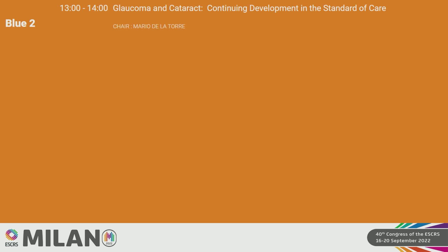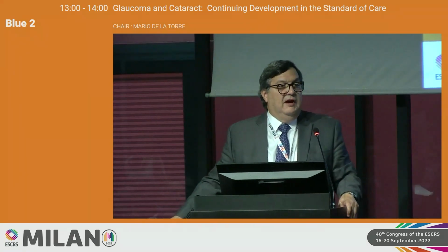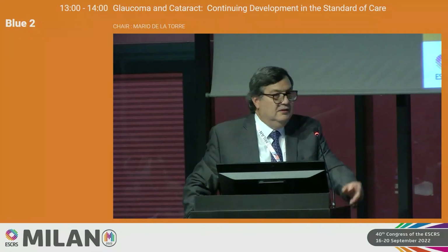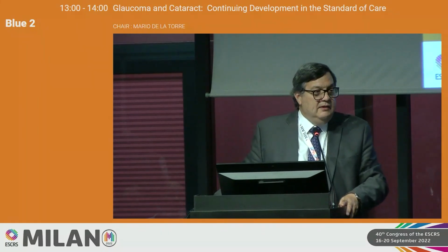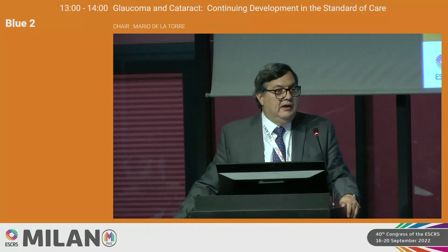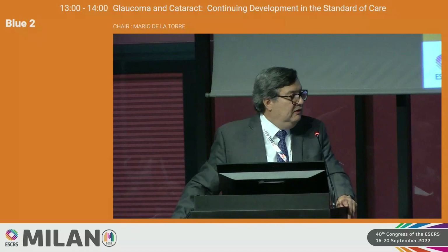Okay. Brilliant presentation. We can highlight first, we have a new device that we can do as we usually do manually. We made the offset posterior. Right now we have the possibility to move it, for a function of the device. Second, we know that it's necessary to use the lens and exactly the right one. And the most important feature that Dr. Brasse tells us is we can perform a very clean, safe, and floater-free capsulotomy without pitting the lens in IOL Premium.